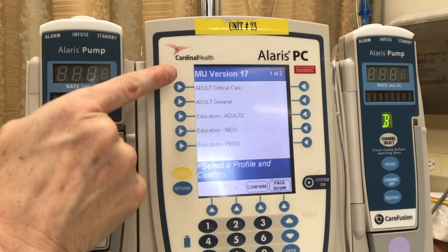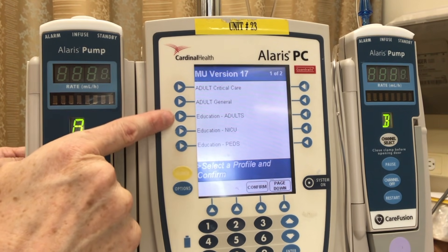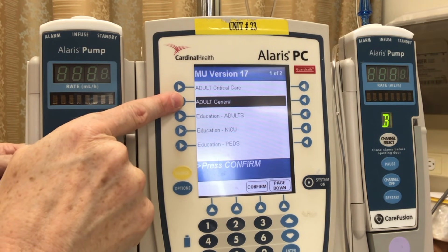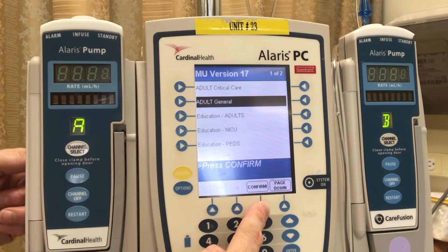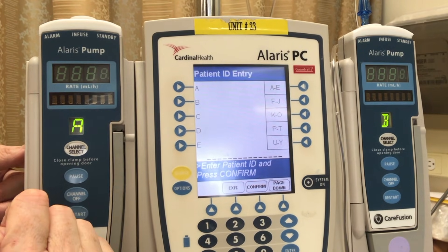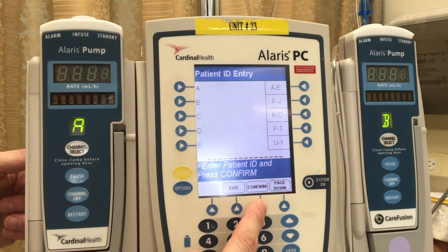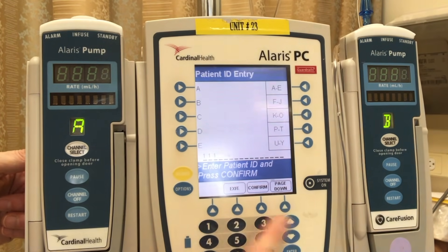Here we have another option to go adult critical care, adult general, education for adults, etc. We are selecting adult general. Confirm at the bottom — let's go ahead and press that confirm. For patient ID entry, you can simply hit confirm at this stage, or you can enter in the patient's ID and then hit confirm.